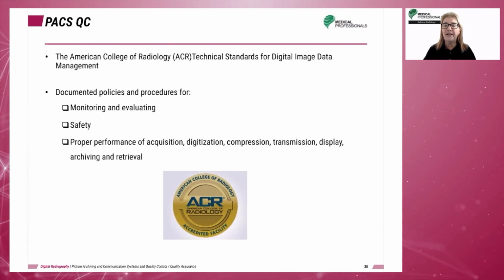The American College of Radiology Technical Standards for Digital Image Data Management Policy states, any facility using a digital image data management system must have documented policies and procedures for monitoring and evaluating the effective management, safety, and proper performance of acquisition, digitization, compression, transmission, display, archiving, and retrieval functions of that system. The quality control program should be designed to maximize the quality and accessibility of the diagnostic information.